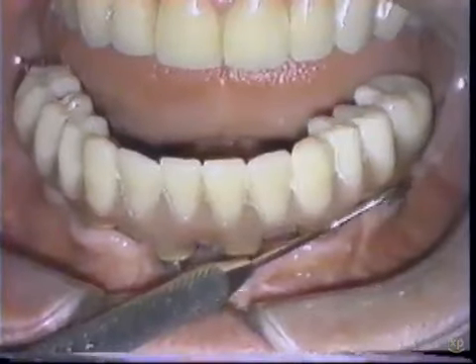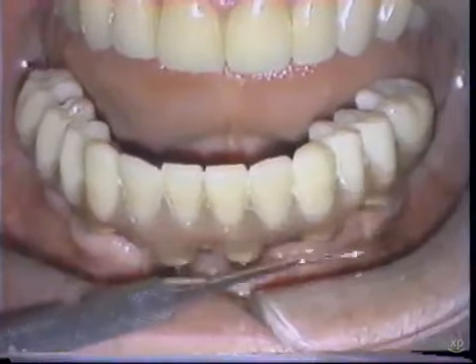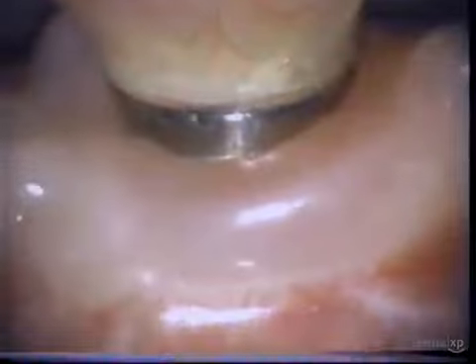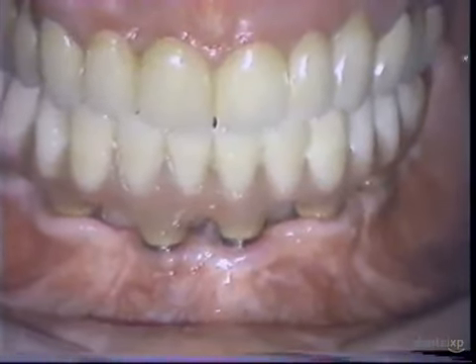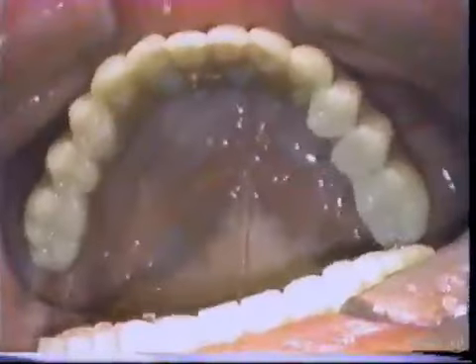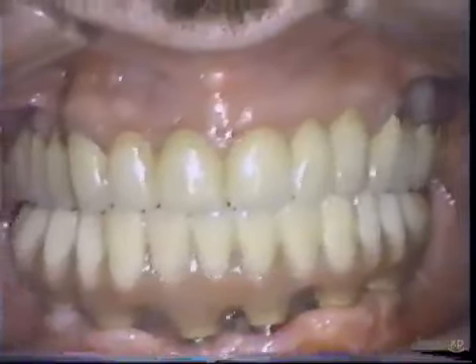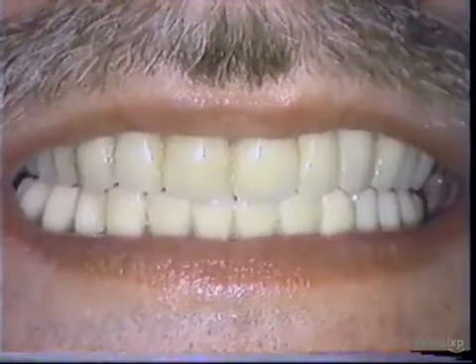So this protocol allows us to take a patient, extract hopeless teeth, place an implant, make a provisional restoration, and take a final impression. And the patient is able to have a final restoration — a hybrid type screw-in prosthesis — at six to eight weeks in most instances. This is one of the techniques that we utilize to treat the fully dentureless patient. In later videos and instructional lectures on immediate loading, I'll go into the single tooth restoration, especially in the aesthetic zone, as well as full arch restoration in the maxilla, and how the two are very different from this particular protocol for the edentulous mandible. Thank you.